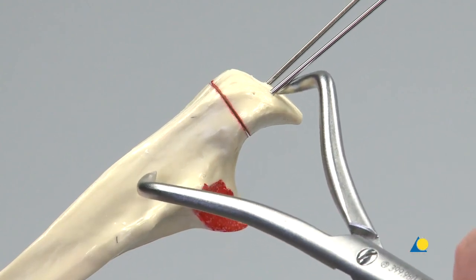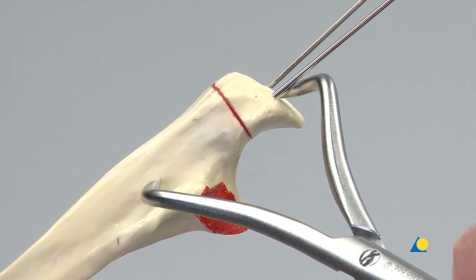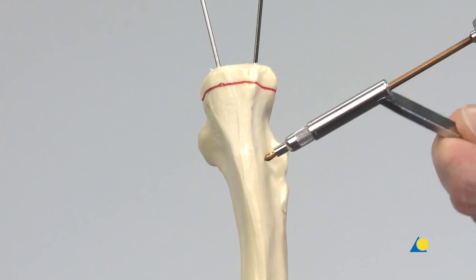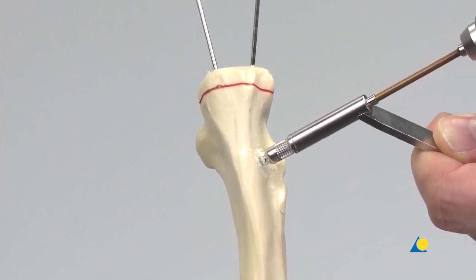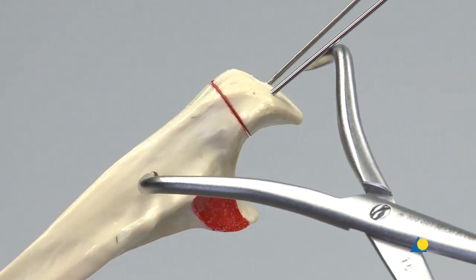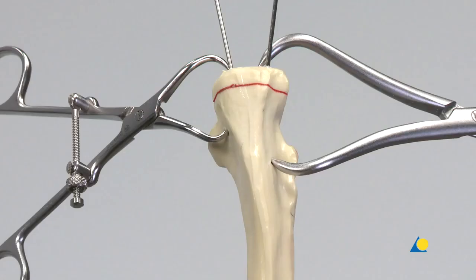The fracture is additionally compressed as much as possible with the large and the small reduction forceps. It is advisable to drill shallow 2.5 mm holes in the bone model to avoid the tips of the forceps slipping during application. The reduction is controlled with direct visualization and under image intensification.